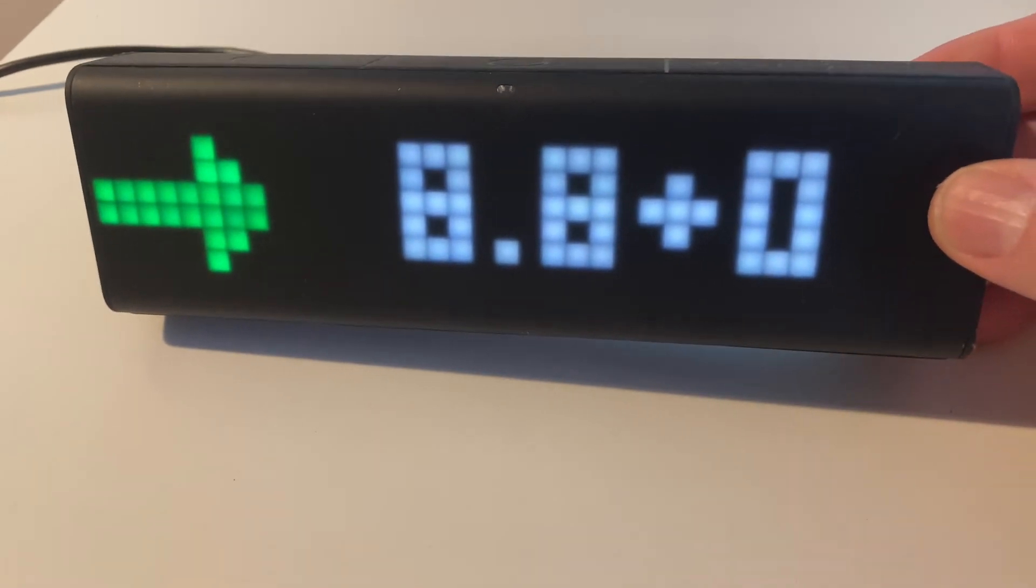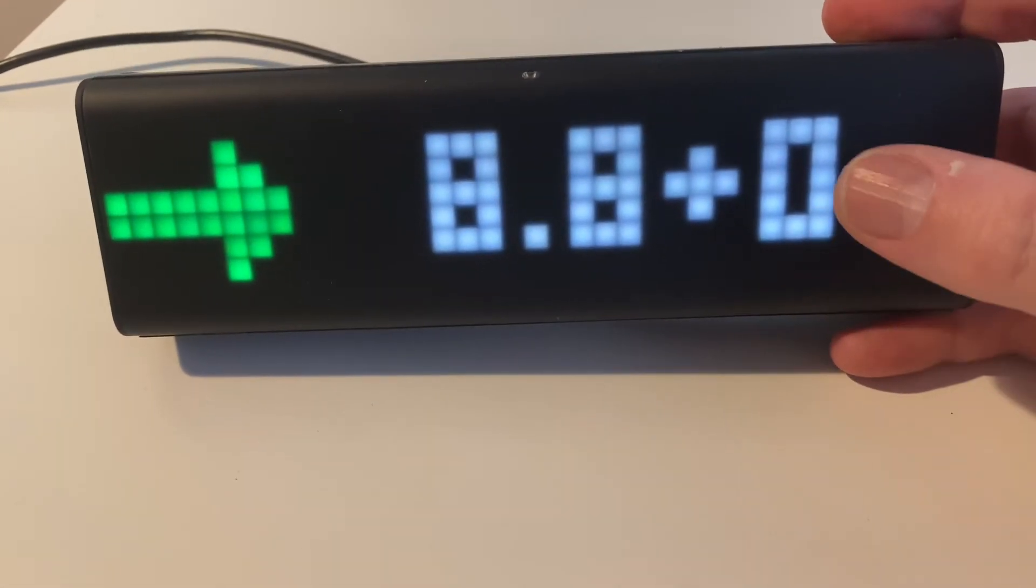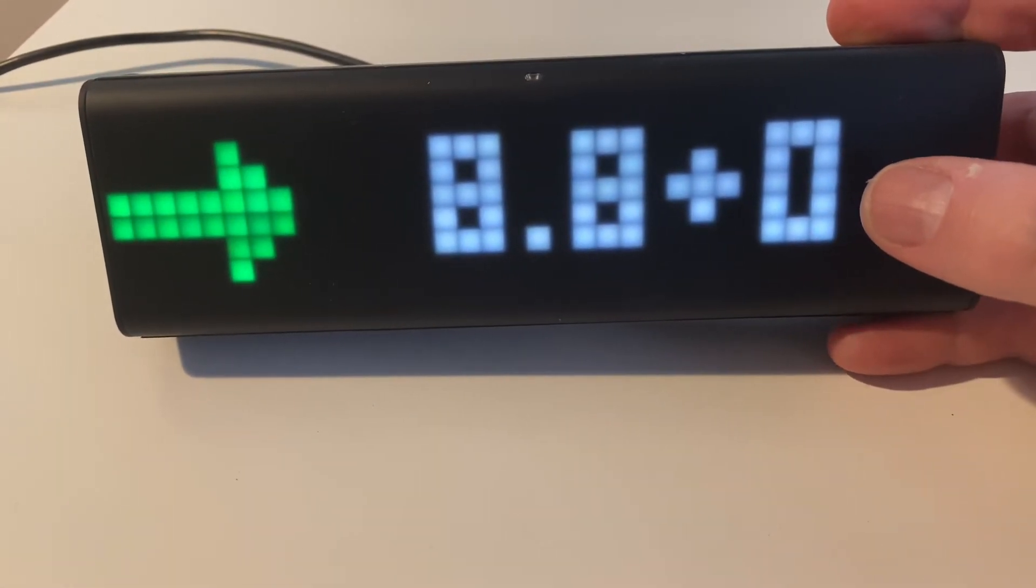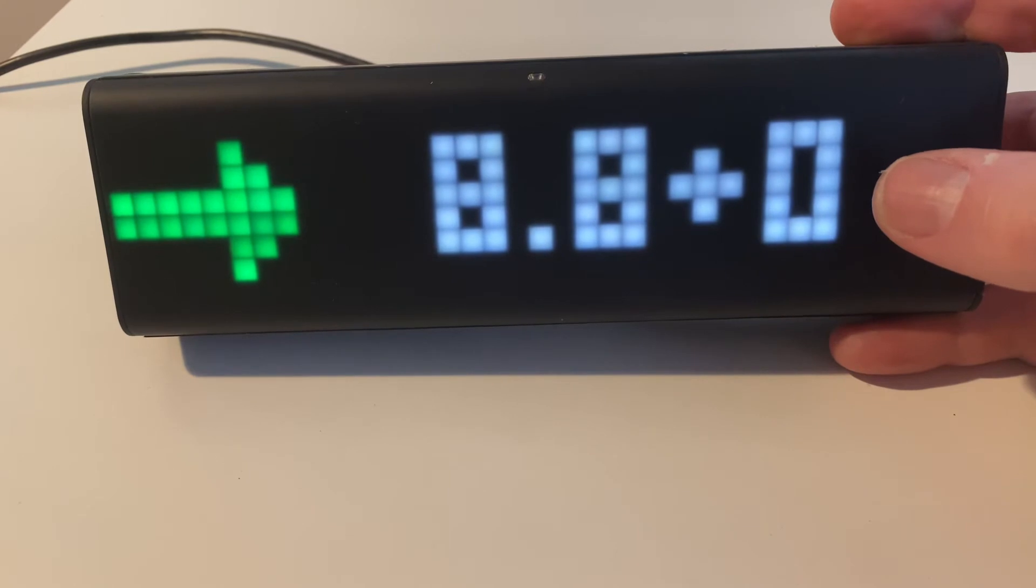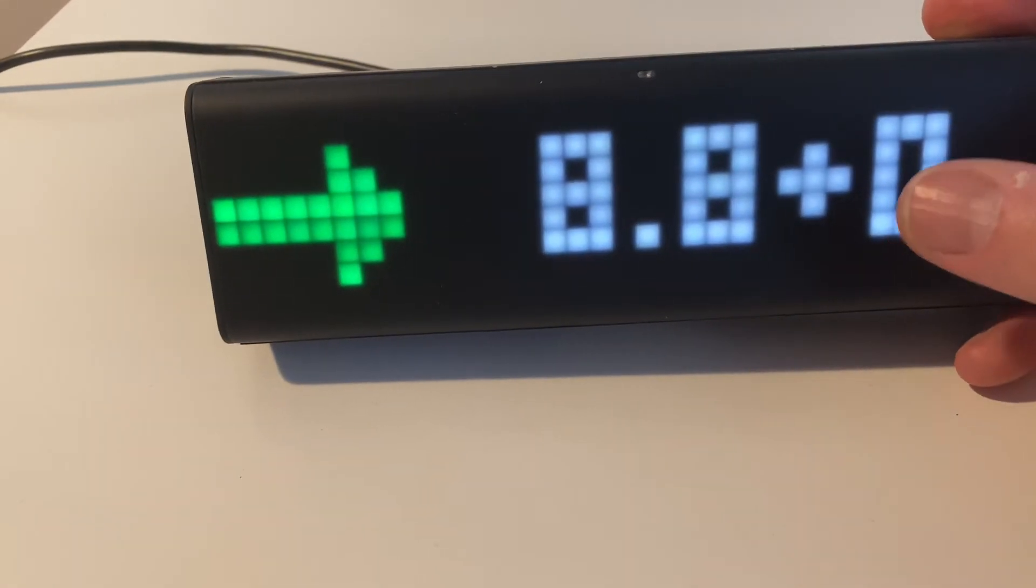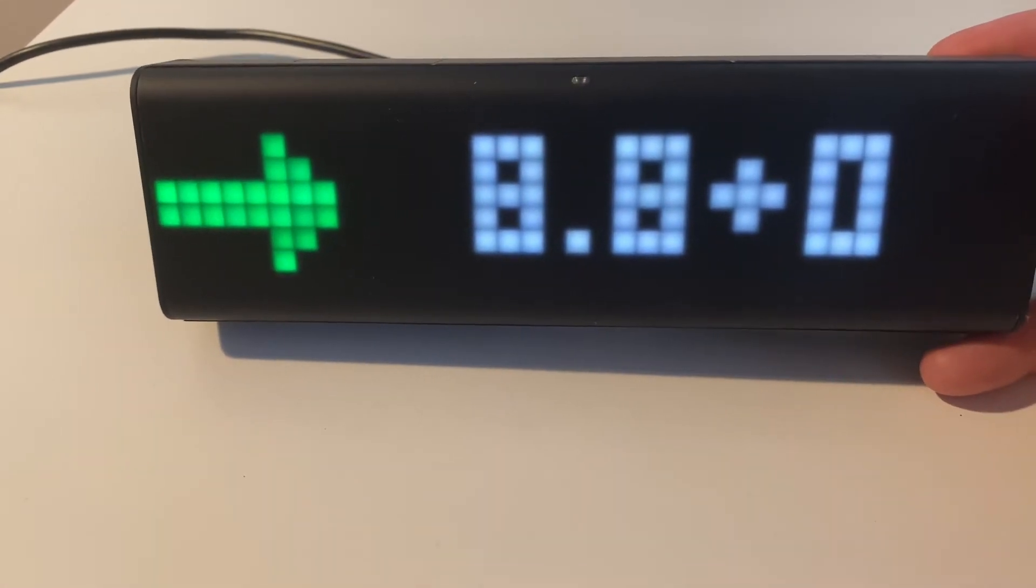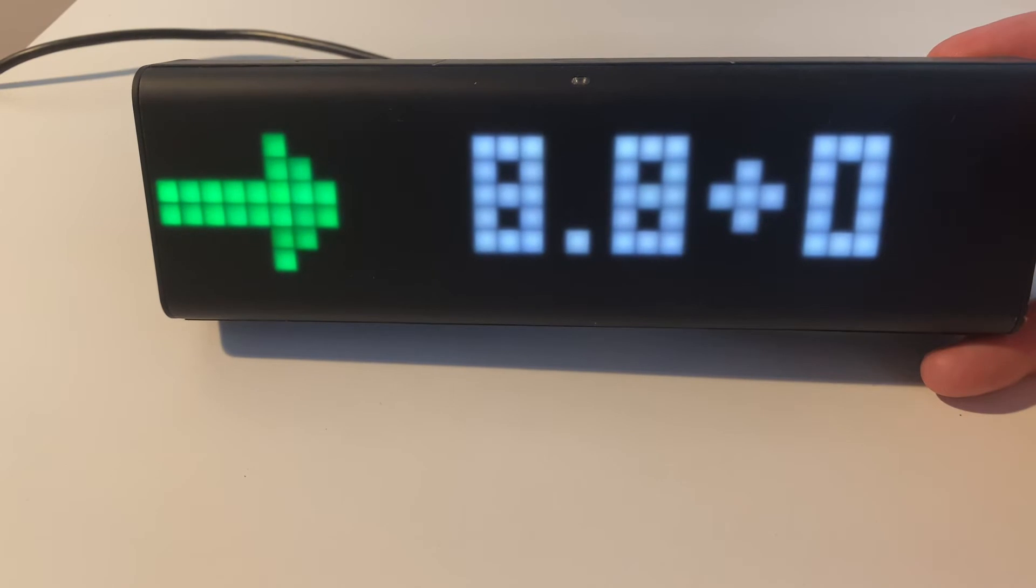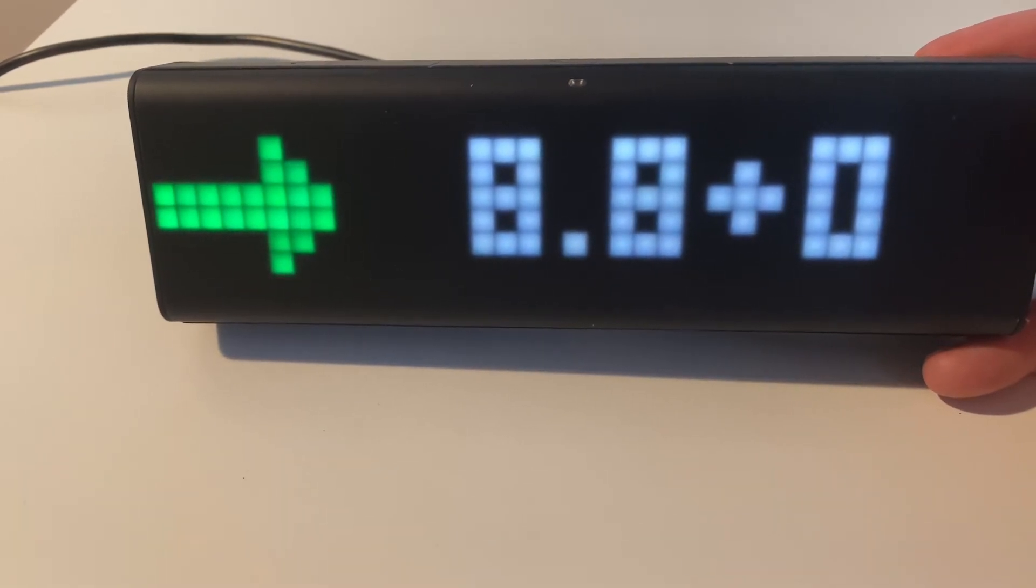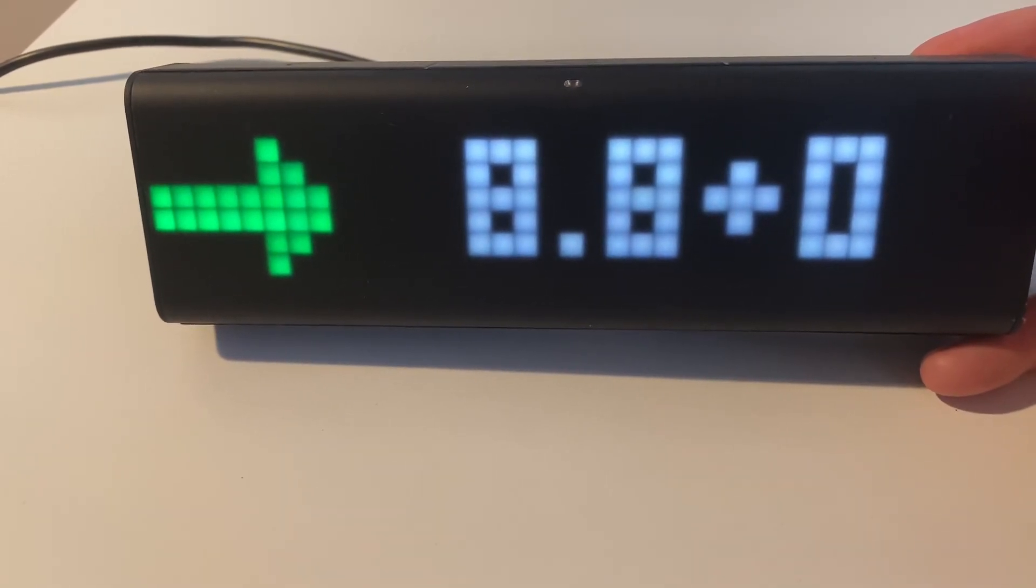And it's constantly updated. It obviously shows you whether you've gone up or down since your last reading, and the arrow changes depending whether it's within range or whether you've gone up or down. So I'm currently kind of constant, slightly high, but it's not too bad.